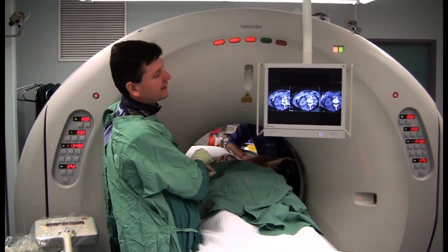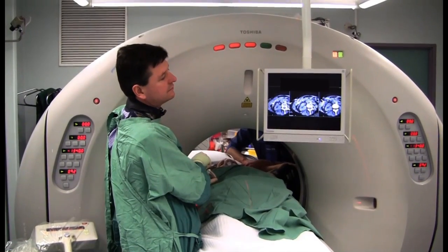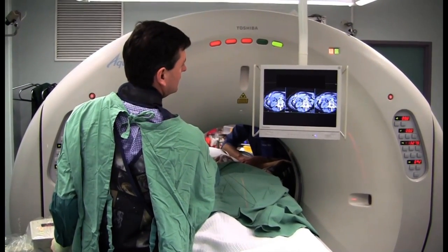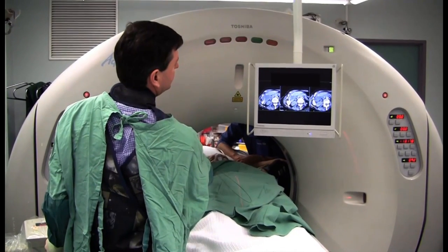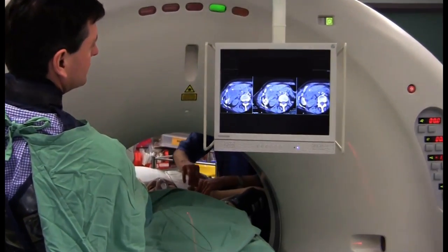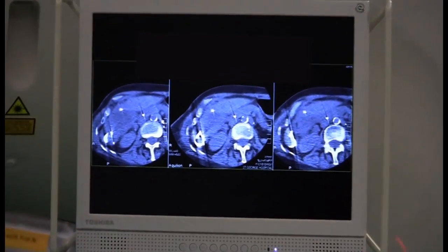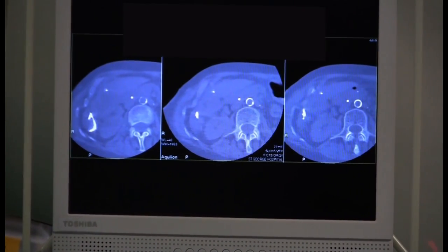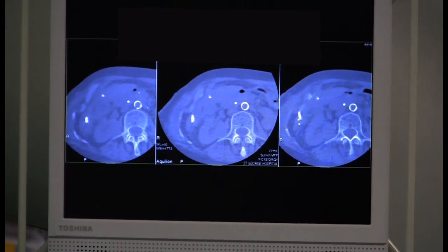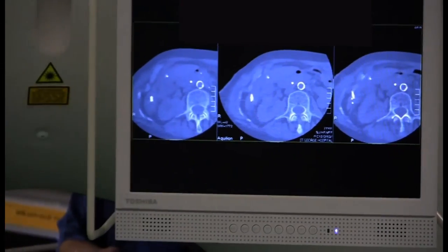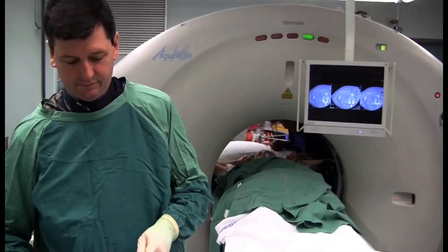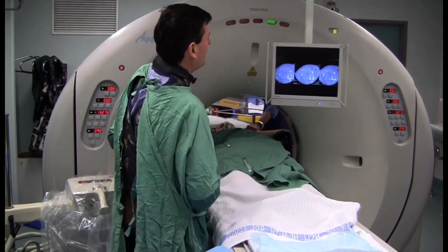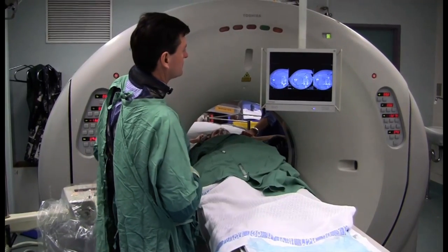A bit of tension on the wire as we advance the drain. Let's go to a wider window — take it out to 1500. You can see the drain there, formed up in a loop. So there's our drain.